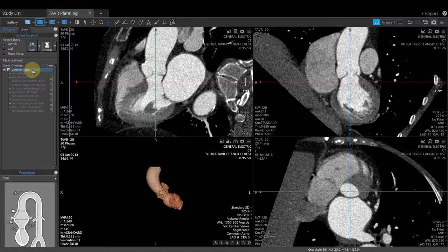To be successful in TAVR planning, follow the worksheet by left-clicking on the measurement, which activates the associated tool. Then create the measurement using the appropriate tool, clicking Done to lock in the measurement, and taking a snapshot to save all of your work up to that point for each measurement.